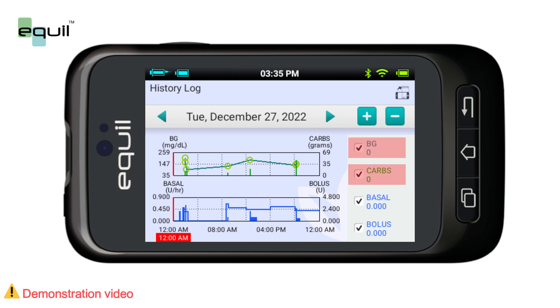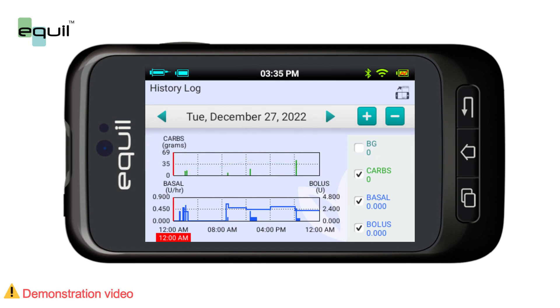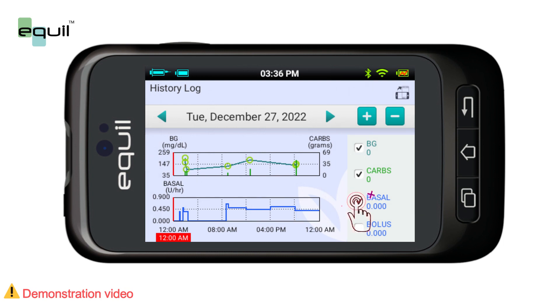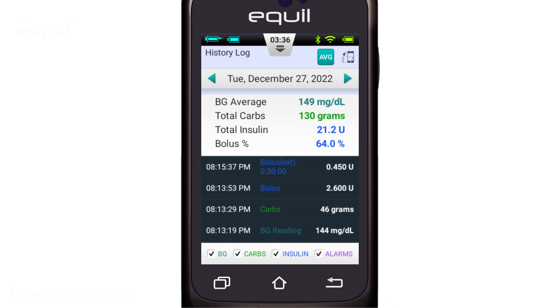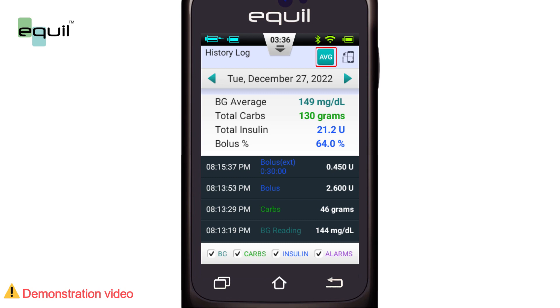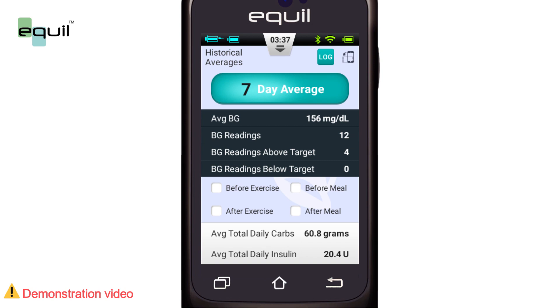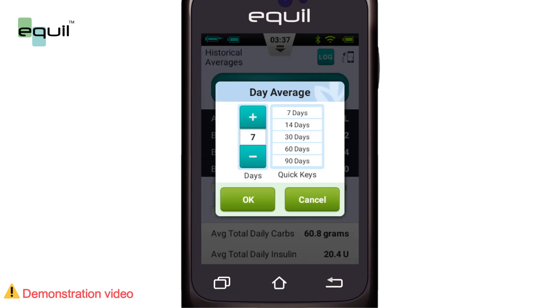The graph illustrates two types of information. The upper chart displays blood glucose measurements as green circles and carbohydrate intakes as vertical green lines. The lower chart exhibits the basal rate as a blue waveform, and boluses are indicated by vertical blue lines. If we want broader averages, pressing the AVG button gives an average for a longer period of time. By default, the duration is one week; however, we can increase this by clicking on it and selecting the desired period from the quick keys, or selecting a specific number of days using the plus and minus buttons.